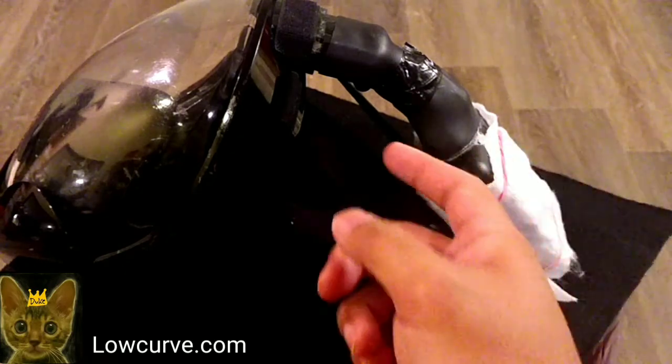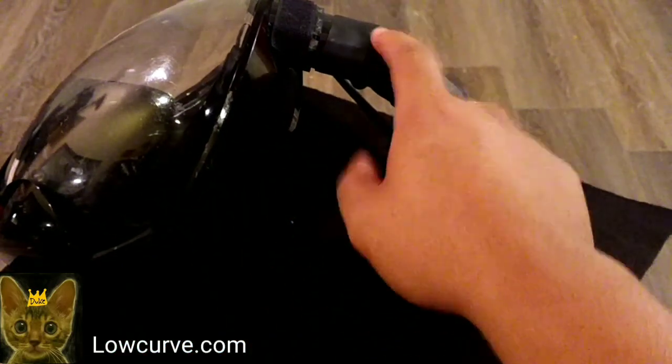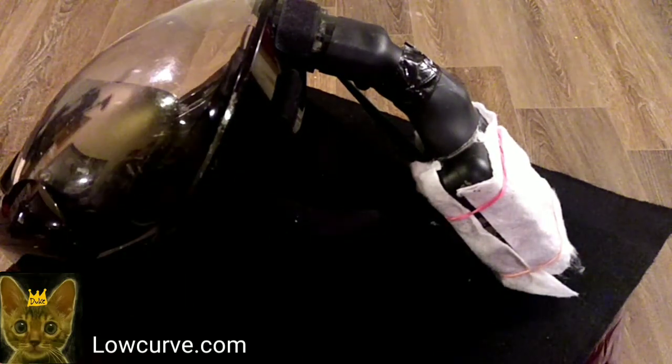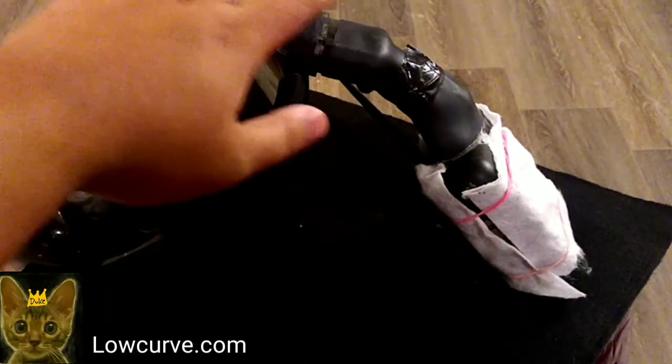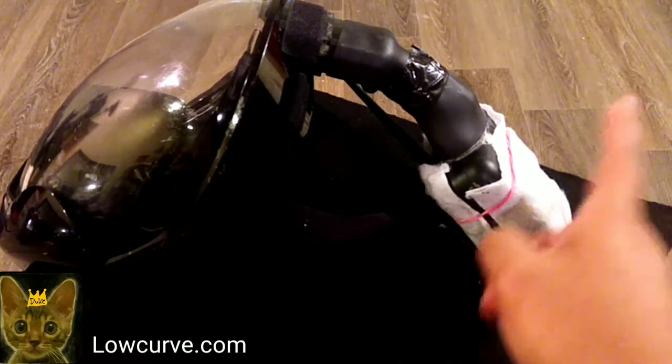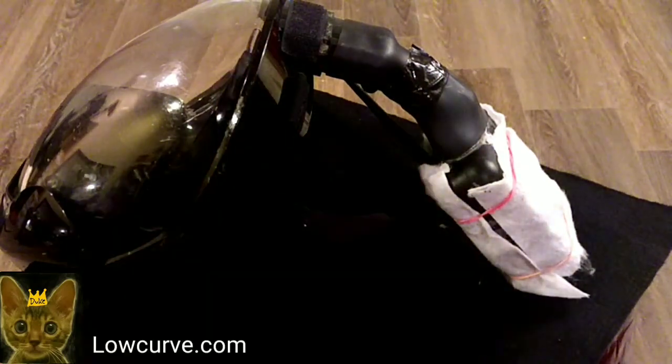It means that all the air which enters through here, as all of the previous tutorials show, all of the air is controlled by, well, in general, with the Infinite N95, in any version, the air coming through the nozzle is controlled by you. You put whatever filter you want on there, whatever disinfecting mechanism, but this one actually will force the air into the nozzle for you.